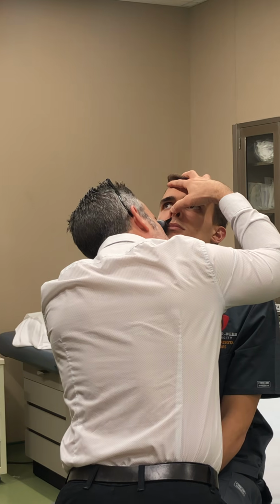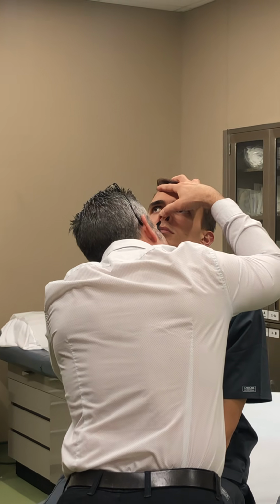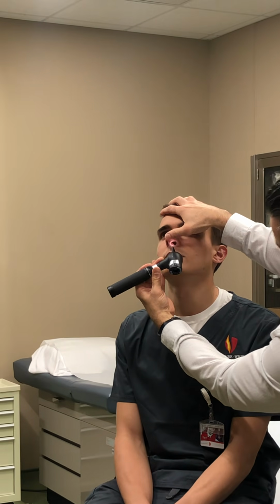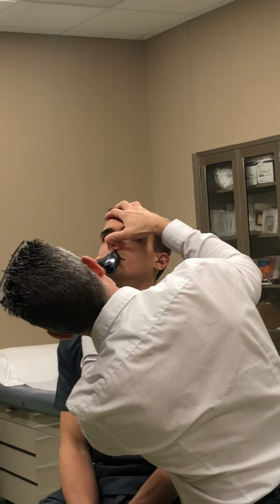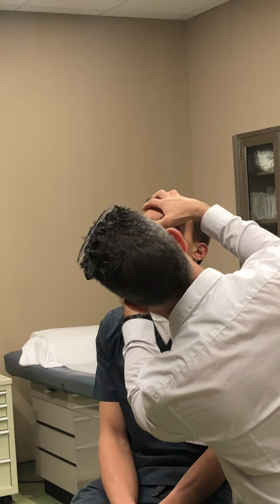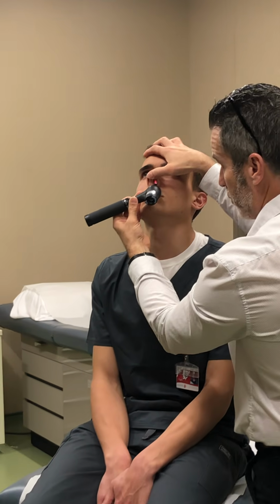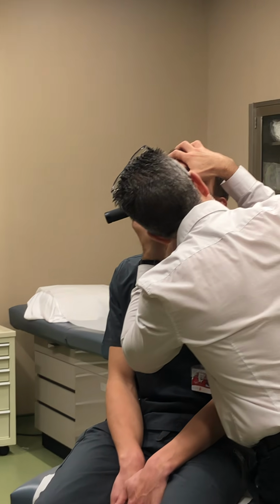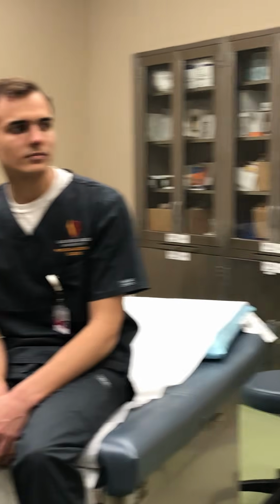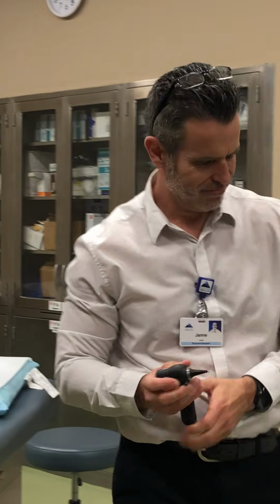Notice how the otoscope does not move. And I'm looking in his nostrils. So I switch, just let you guys see. Look, you can see inside his nose, looking for inflammation, lesions, any type of rhinorrhea. So then, with it being laid there, it's not going to move. I hold it still, come in, and try to look up. And you have to tell the patient sometimes, don't breathe if you can't hold your breath for a minute. Why? Because it'll fog up this otoscope, exactly.